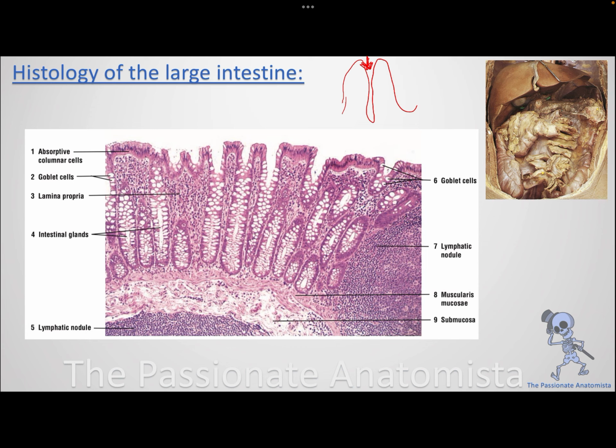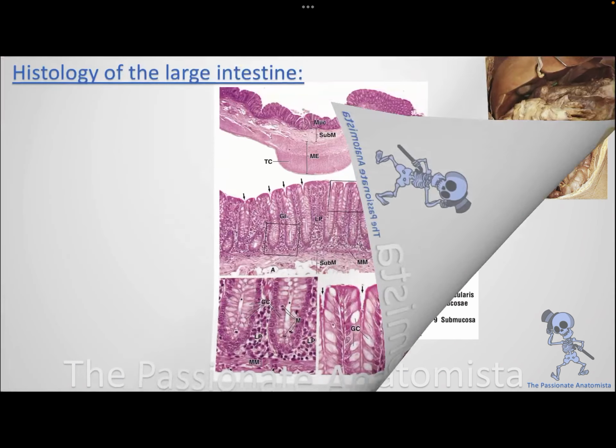They are all lined by your columnar cells. So remember, we have foldings, and now you have an idea about the foldings that I have. Here also we call them valves, and these are all the foldings of your epithelium, because you need to have so many cells, and a lot of goblet cells that are secreting mucus to lubricate the canal at that point. And these are all columnar cells. The core of these foldings is your lamina propria. And of course you know the general organization of the GIT by now.